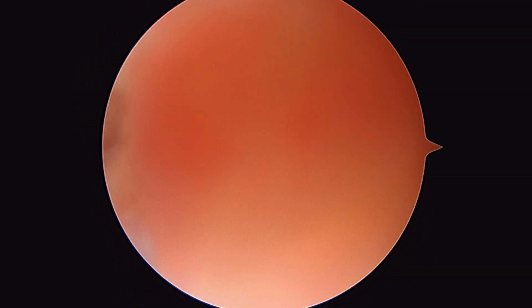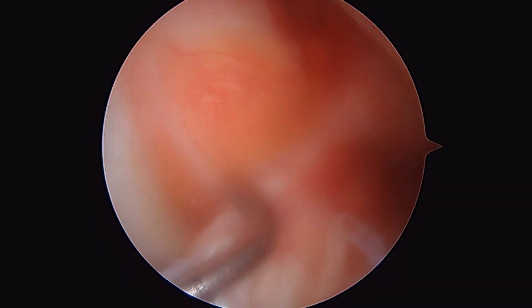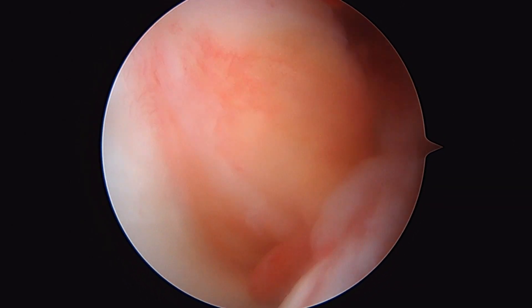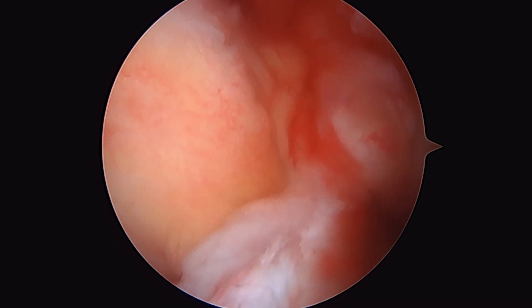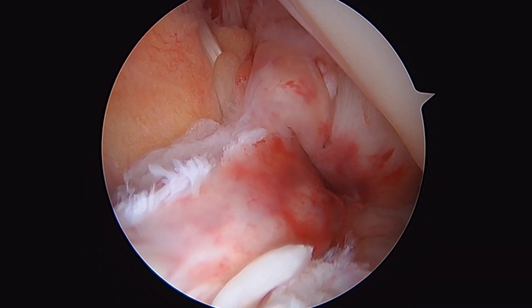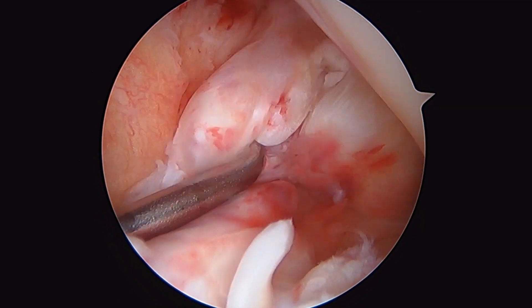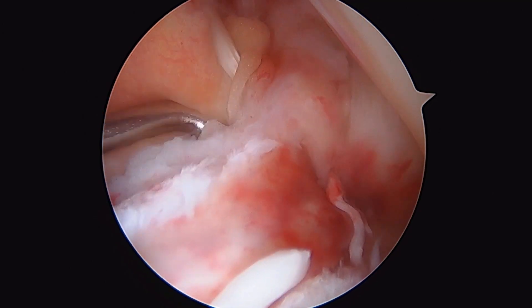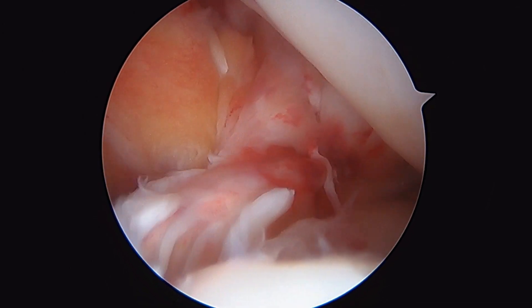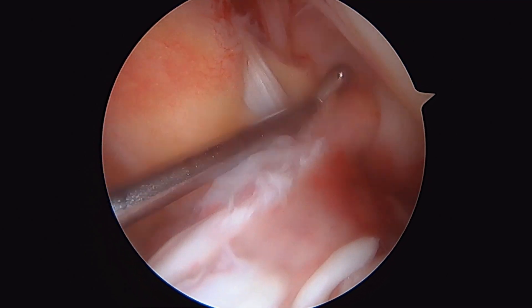As we come here into the intercondylar notch of the knee, you're going to see her problem. This is a fairly acute ACL rupture. To the left here is the PCL. There you can see the remnant of a ruptured ACL with a bundled up ligament — that's a complete rupture of the ACL, left knee. We're going to reconstruct the ACL using the patella tendon.